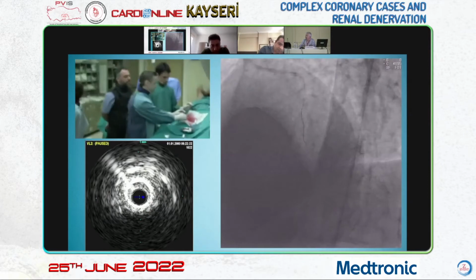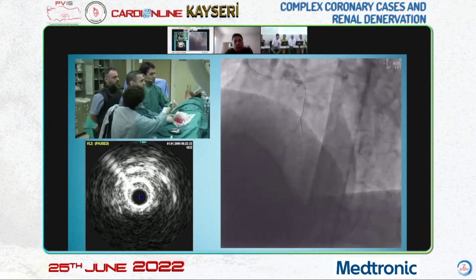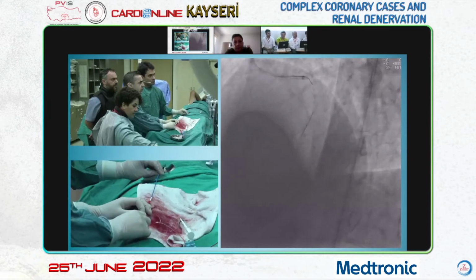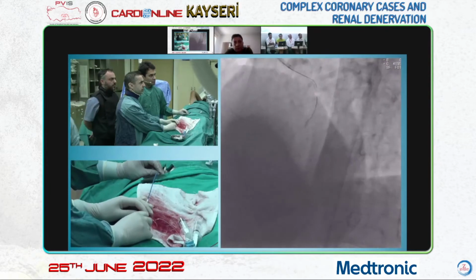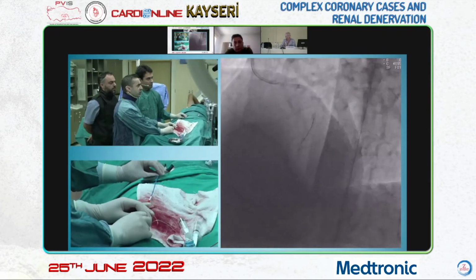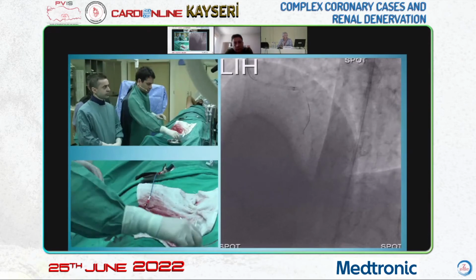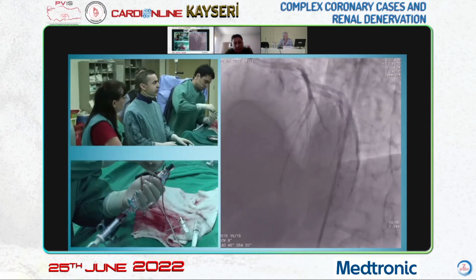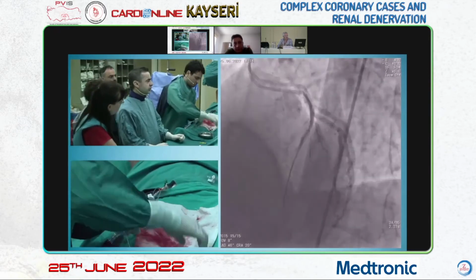I don't think that this runoff is very good. There is a stenosis risk and a thrombosis risk. What happens with normal ballooning? If they give nitrate, everyone thinks that there's a spasm. I will take out the wires. Let's have a nitrate and wait. So we can see the left cranial angle. Let's first see from the right hand side.